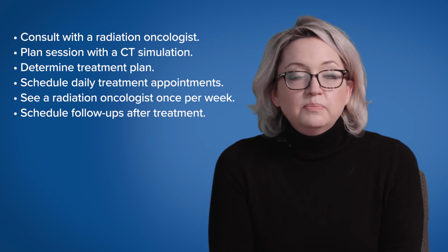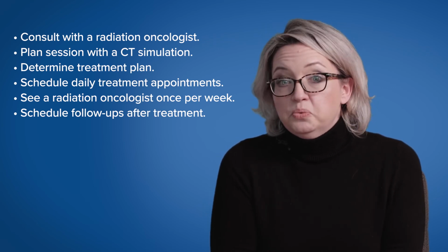Once that plan is done, now we're in this window, right? I've had my planning session, but I haven't started my treatments. What the heck are we doing? There's sometimes a 10-day window between those two appointments, and we're doing a lot of behind-the-scenes work to design a treatment plan that's specific to you.